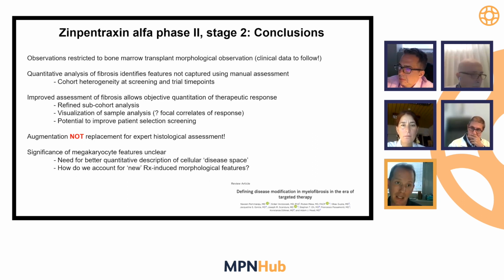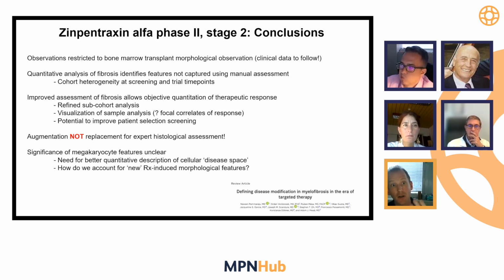And my experience, anecdotally, is that when you take three pathologists who disagree, or there's discordance on a case, when you show them this kind of visualization as an objective measure of the features, it's a very good way of constructing a discussion and clarifying the disagreement or doubt upon biopsies, particularly when looking at focal abnormalities.